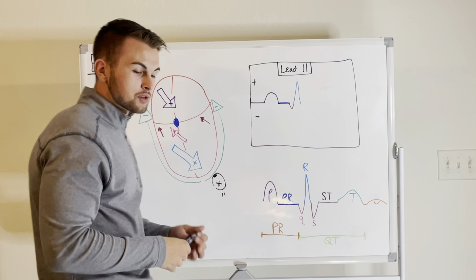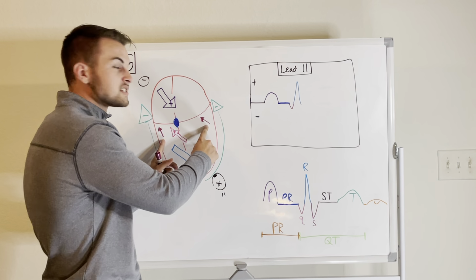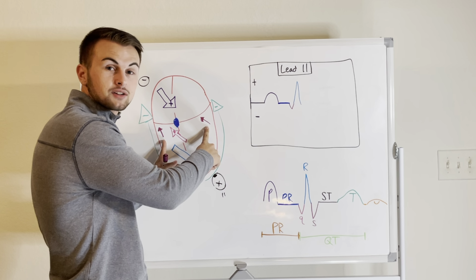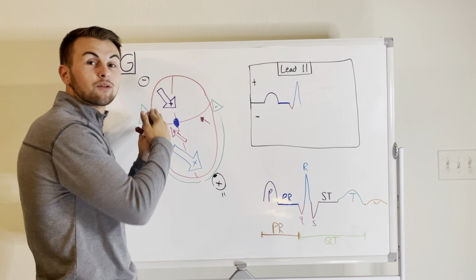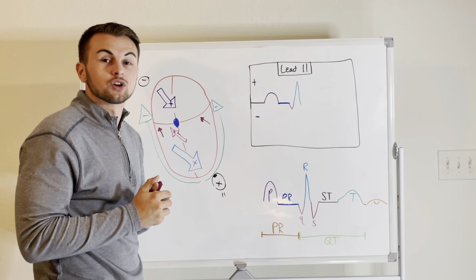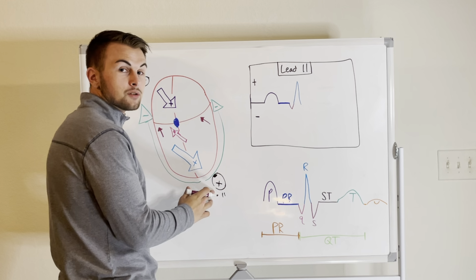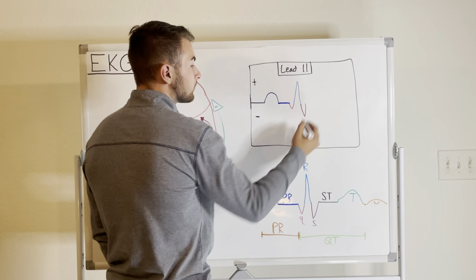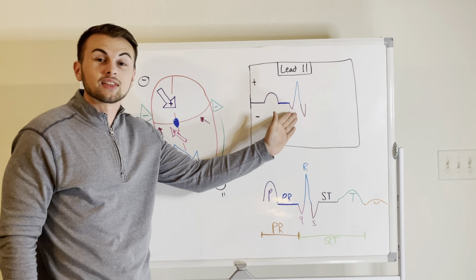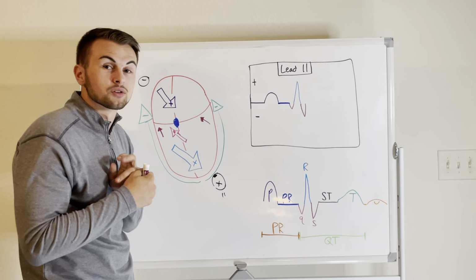Now, the last parts of the ventricles to depolarize, rather, are the bases of the ventricles. These two bases have depolarizing positive vectors that travel upwards and rightwards, away from our positive lead camera. So we already know that this is going to create a negative deflection. Remember, the pretty lady is heading away from you. So what do you feel? You feel sad. And basically, we call this wave the S wave. We know that the S wave is representative of ventricular basal depolarization.